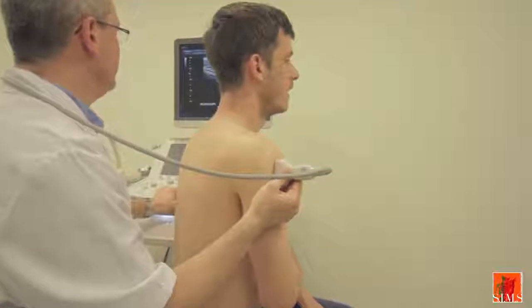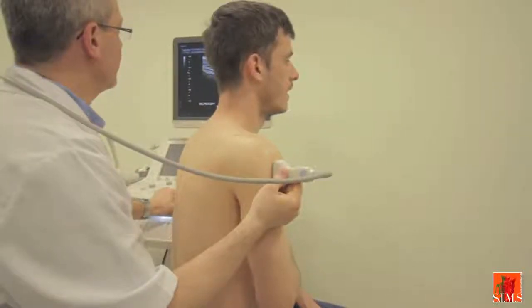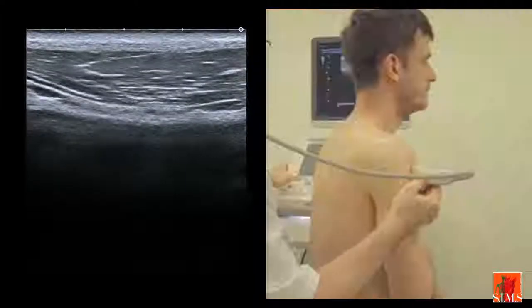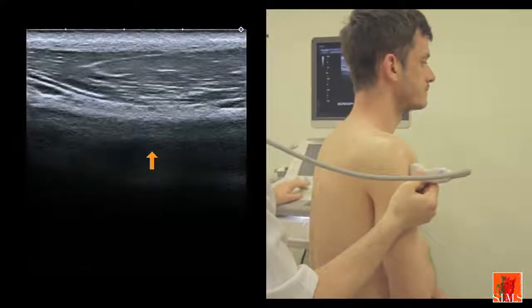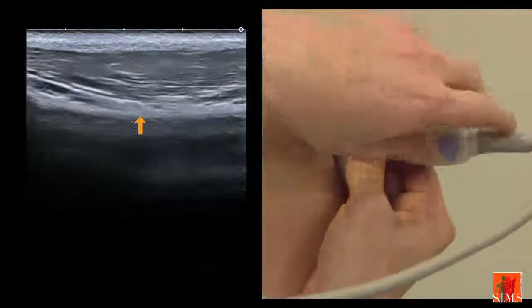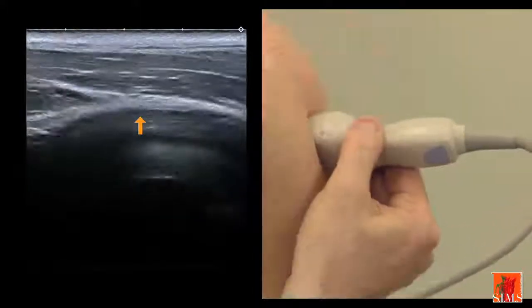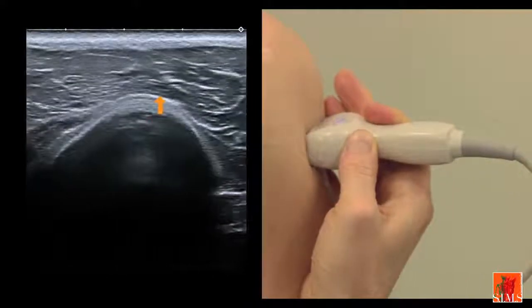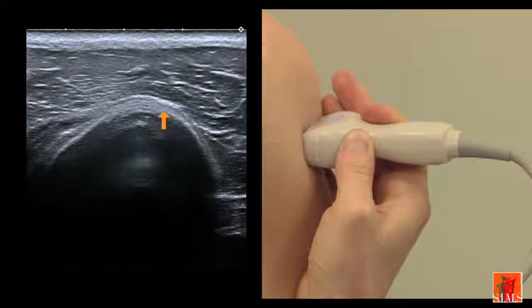We will end with an image of the axillary nerve. This time we locate the axillary nerve on the lateral border of the diaphysis of the humerus — here you can see the artery, and here the small nerve. We then tilt the transducer by 90 degrees in order to obtain the long axis view of the axillary nerve, as you can see here.